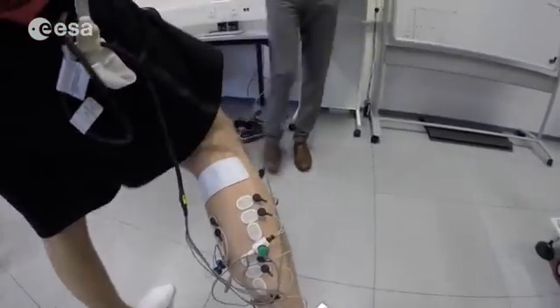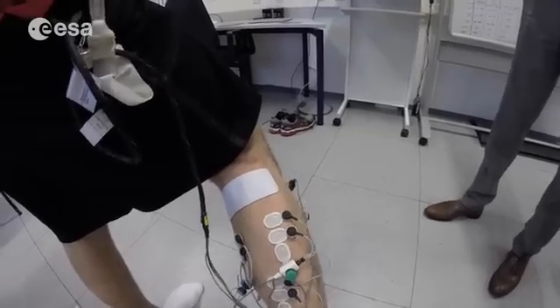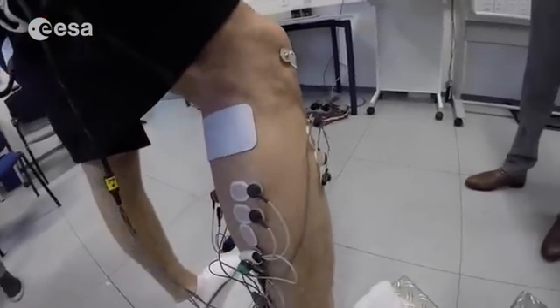Of course, the electrical stimulation is applied through a whole series of electrodes attached to my leg like that, and that's of course why it's necessary to shave almost the entire leg. All right, we'll have to repeat that whole series of tests on board the ISS later this year, so it should be fun.